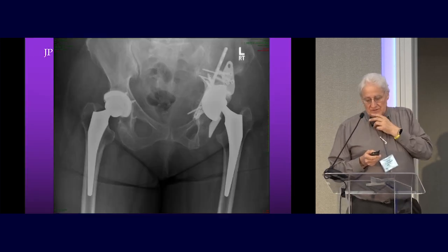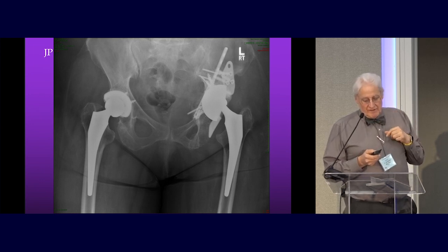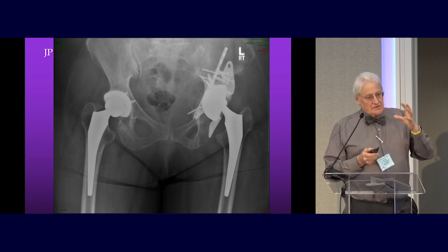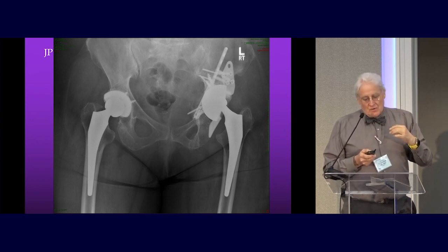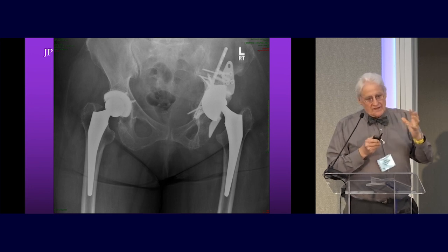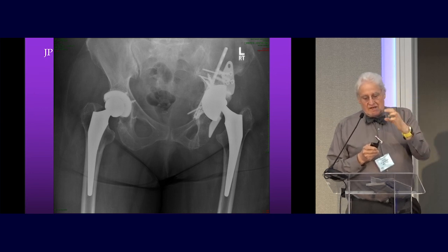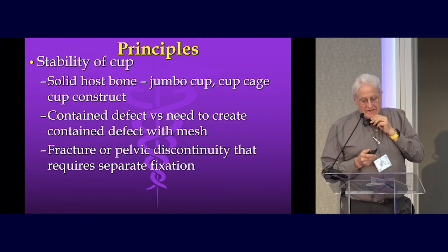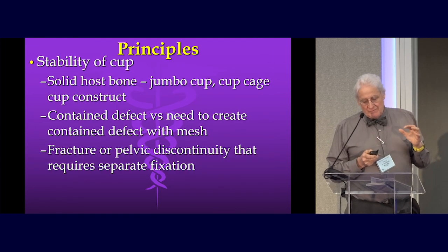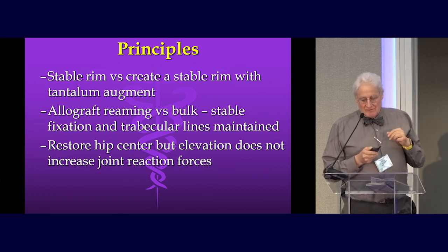So JP was somewhat similar. We put a plate in there with some allograft, and felt like we got pretty good stability. Now you can see that's really vertical. That's not the real cup portion per se. The poly we've cemented into it. So I put that big cup where I can get some stability, then I cement the polyethylene cup inside the cage and put that at a better position. So the key: make sure you get a stable implant before you put anything in there, or a stable column and rim. Otherwise, it's going to fall apart very quickly.